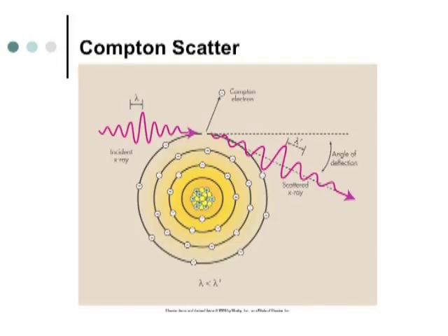Some people refer to it as backscatter. Have you heard that term, backscatter? The greatest amount is going to be produced in the same direction that it's coming from. So if you're standing by the X-ray tube and the X-ray is going through the patient, most of the scatter radiation is going to be coming back at you at higher kVPs. 120 to 130 degrees is the greatest area of backscattered radiation from a patient.